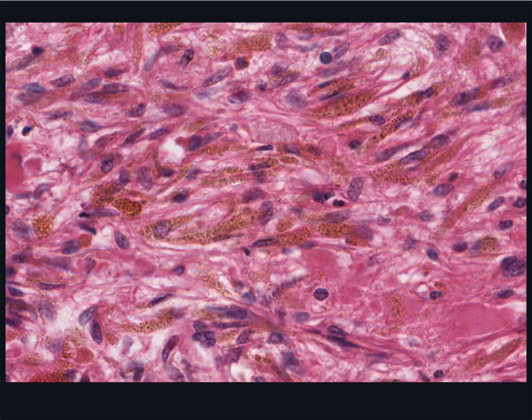As I pointed out when showing you the pituitary stalk, most of the nuclei you see are pituicytes, particularly these nice rounded ones. But obviously, some will be the endothelial cells lining blood capillaries, and they will tend to be more flattened or elongated.